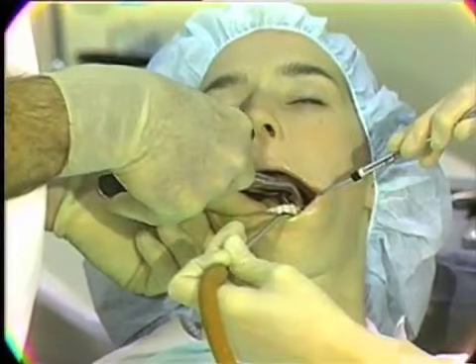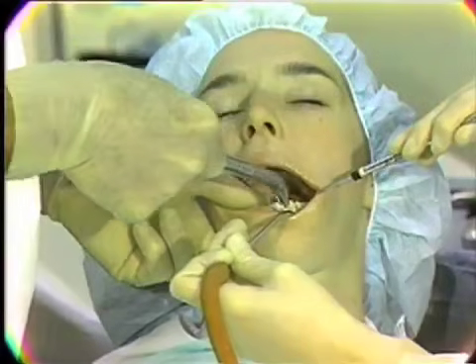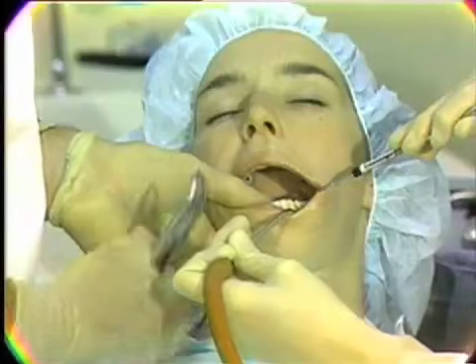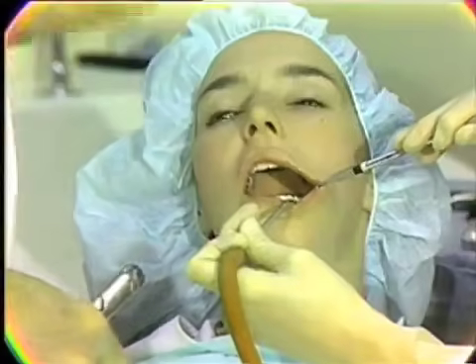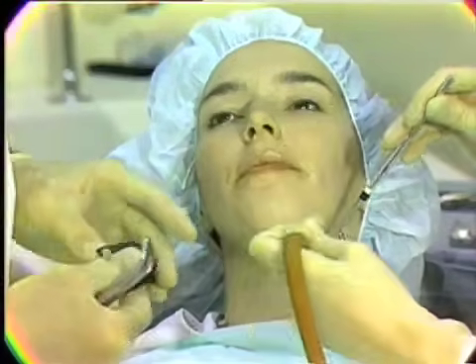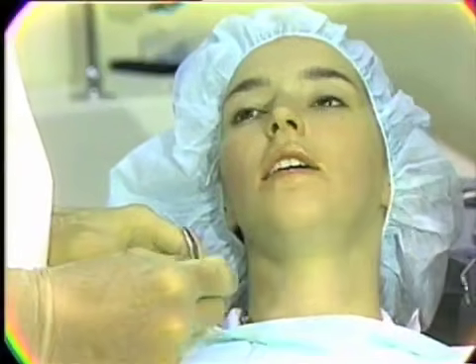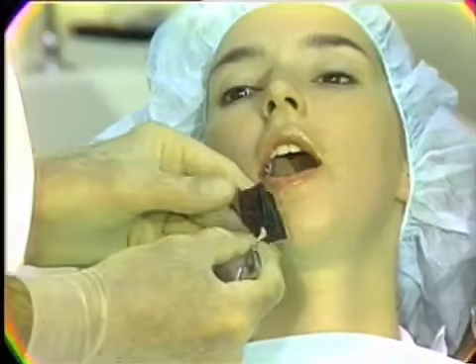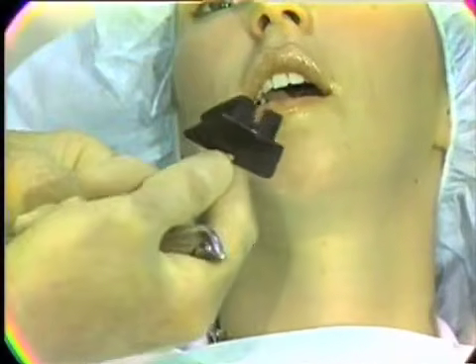In conical shaped roots, we can add to the buccolingual motion an element of torsion in any single-rooted tooth that tends to have a conical root configuration. Another method for the support of the mandible so that the patient can use their own muscles of mastication to support the jaw while we're using forces of elevators and forceps is the use of a rubber bite block, shown here. The patient is instructed of its use.